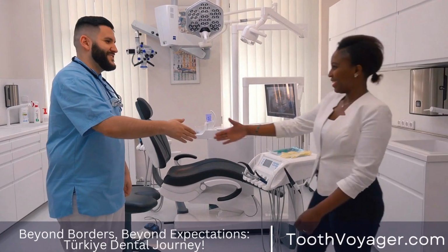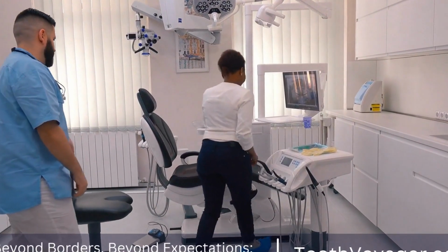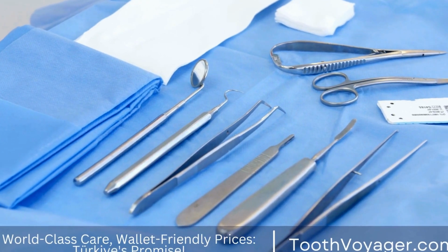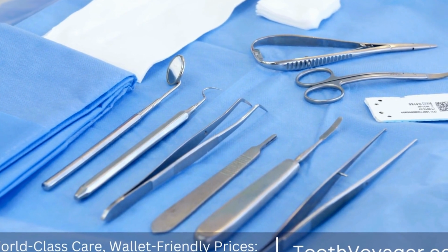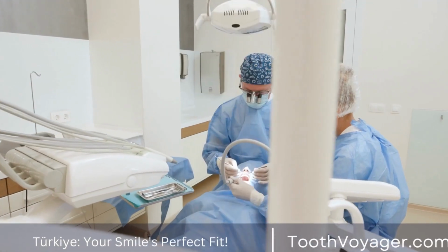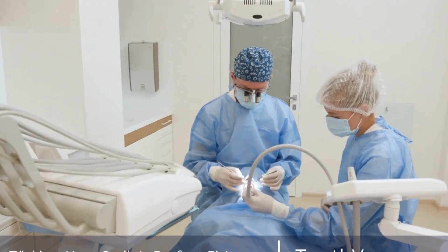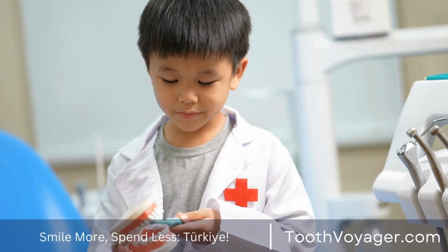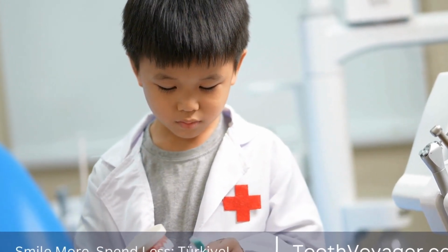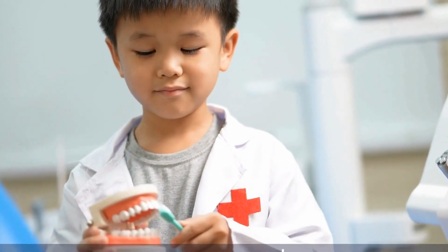The process of implant dentistry consists of two major steps that are osseointegration and the final restoration. The process of osseointegration occurs when the implant joins with the jawbone to create a solid base to support the implants. The last stage of restoration is the attachment of the abutment and the crown onto the implant, giving a natural and practical outcome. Patients are required to adhere to the instructions of their dentist and follow good dental hygiene practices to guarantee the successful operation of their dental implants.